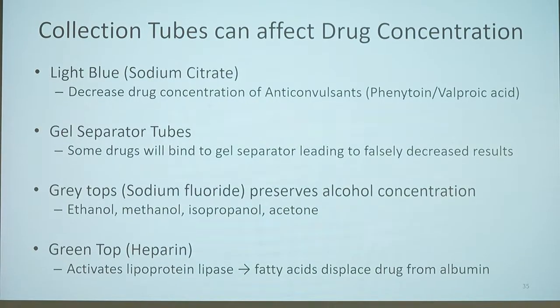So when fatty acids bind, they kick the drug off, and that gives you a false elevation of the amount of free drug in the blood. So these are why you don't use these tubes to measure TDM, or even for drugs of abuse testing particularly. You would use gray tops for DAT testing if you collected a blood sample.